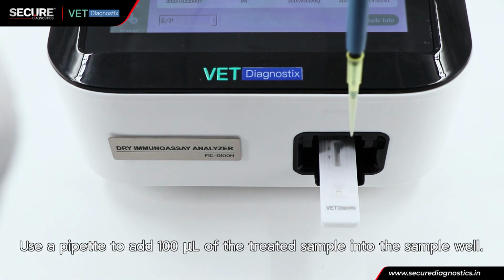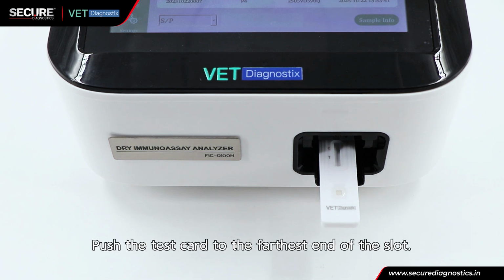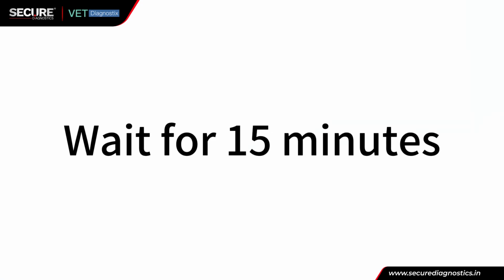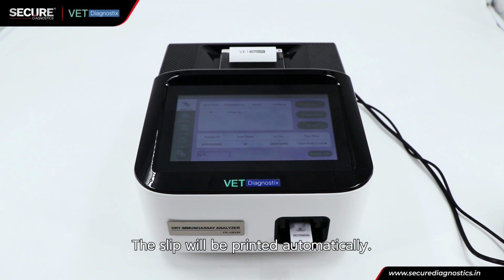Use a pipette to add 100 microliter of the treated sample into the sample well. Push the test card to the farthest end of the slot. Tap Standard Test on the screen to start the testing. The slip will be printed automatically.